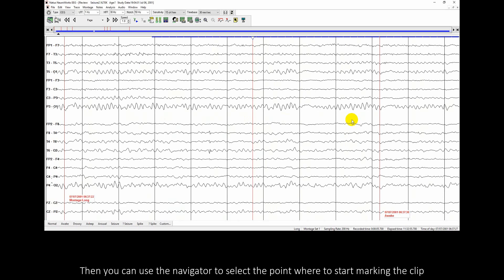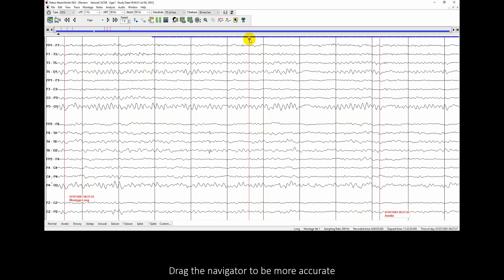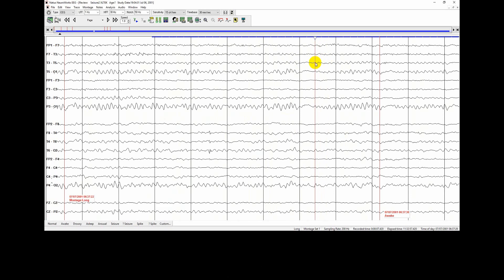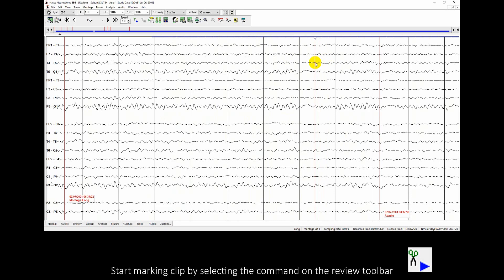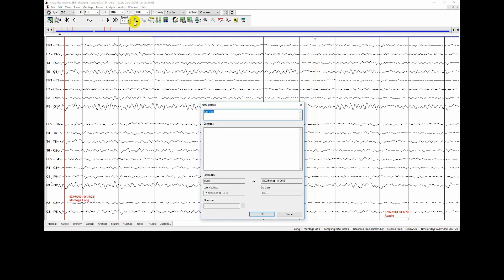Use the navigator to select the point where to start marking the clip. Drag the navigator to be more accurate. Start marking the clip by selecting the command on the review toolbar, then assign a title to the clip and press OK.